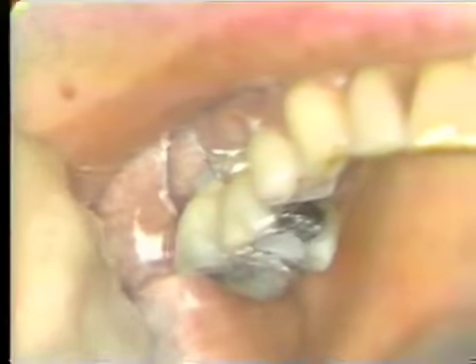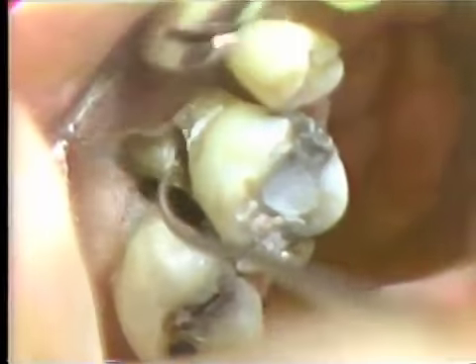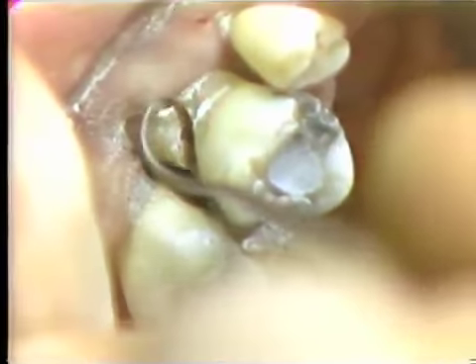Explorer. Periodically, a Cowhorn explorer is used to check to see if we are through the root. Care must be taken not to nick the lingual or the mesial buccal root.